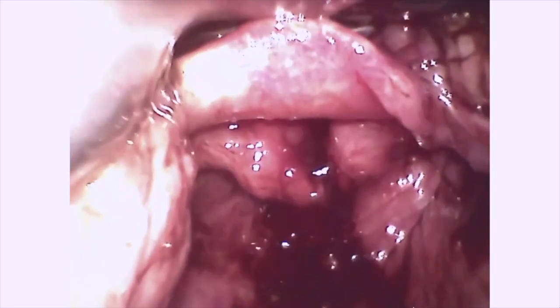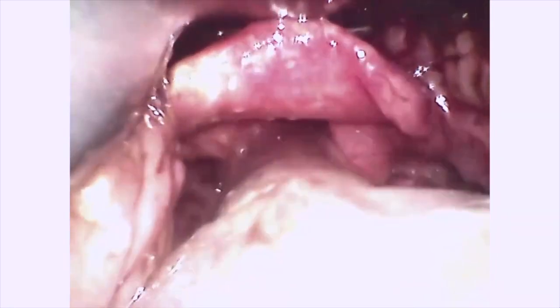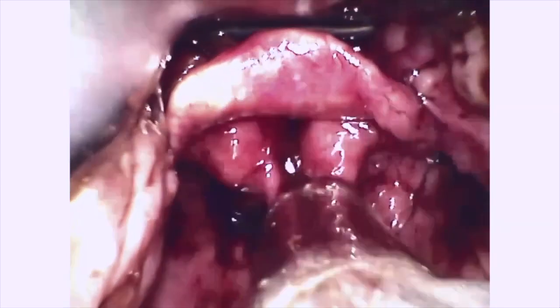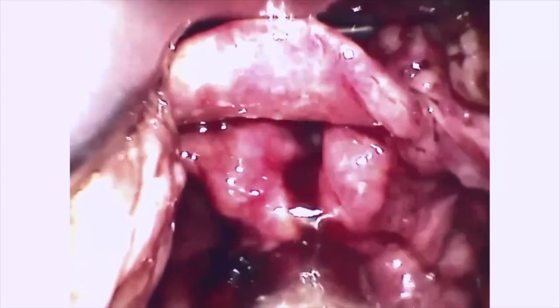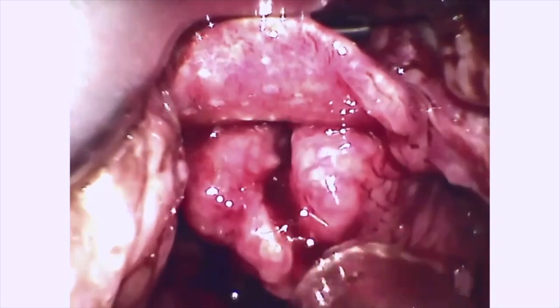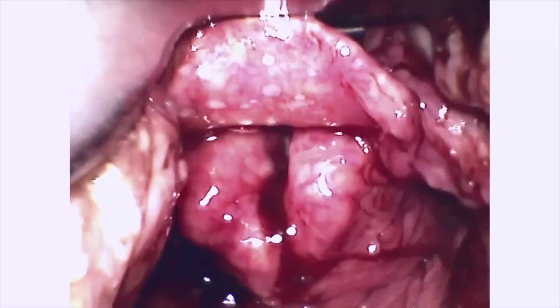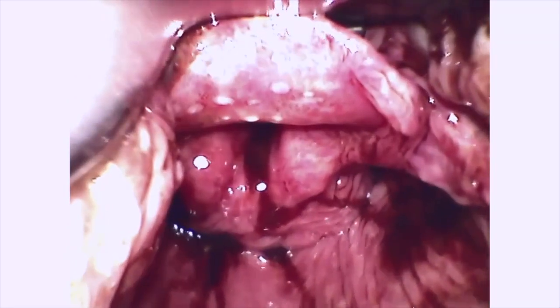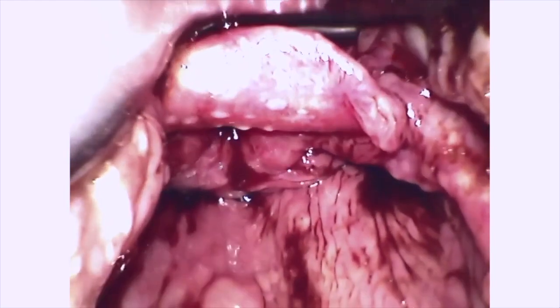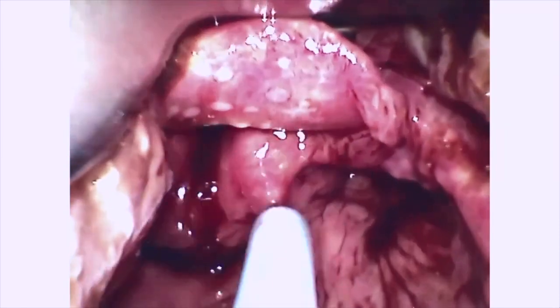And there we see pivoting on the hyoepiglottic ligament, we get exposure, but we're not getting great exposure. Go ahead. I would definitely think of a bougie if you're going to make that at all. Yeah. I'd probably pull back a little bit too. I feel like if you're doing this with video, you have less than a third of the inferior aspects. So you want to optimize it a little bit more, especially if you're using a hyperangulated blade.